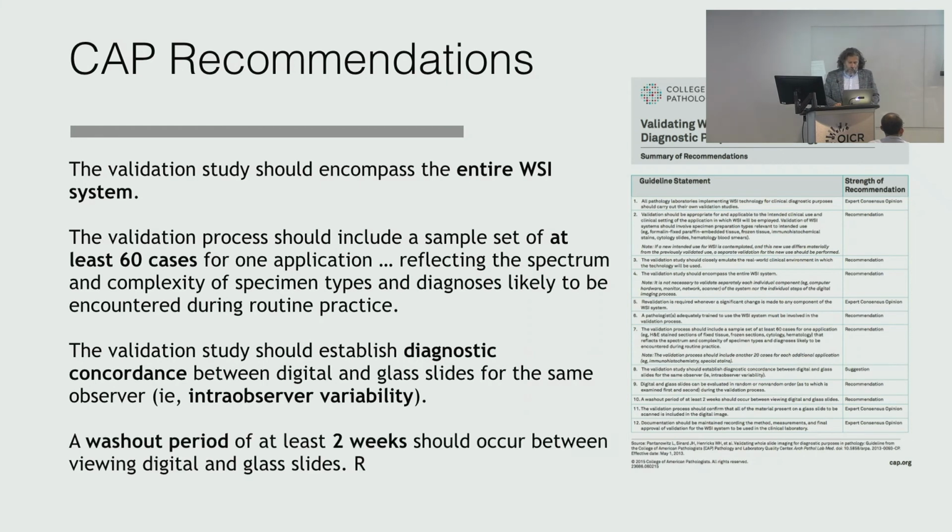So why isn't it 100? Well, because we are human, the perception is incomplete, things are incomplete, we get tired, we make mistakes, many other reasons. I don't think we can ever reach 100%, not just for digital versus conventional. I would argue in some cases even microscopy against microscopy, because we have inter-observer variability. Just put the digital pathology aside.